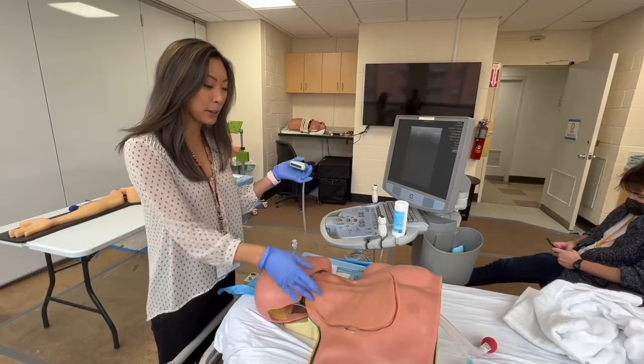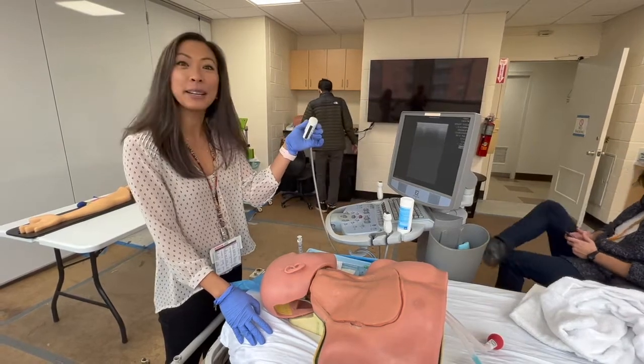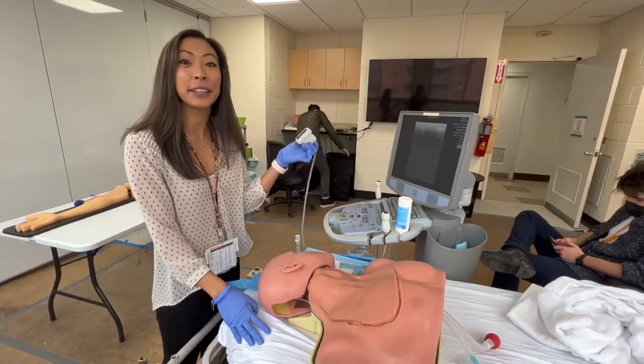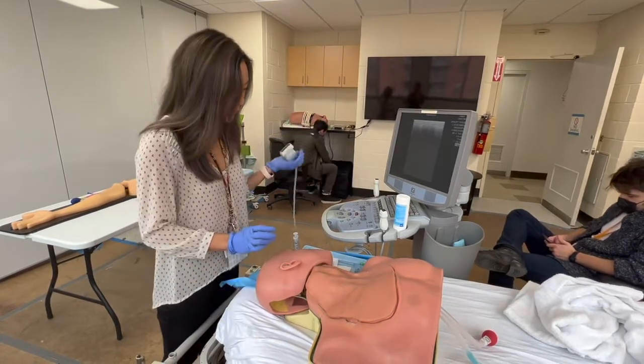So first, we're going to put it in the IJ using your ultrasound. If you're doing this sterilely, there's going to be a probe cover on it, but in a lot of situations — like a crash line — it could be dirty, so we'll pretend that this is sterile for now.